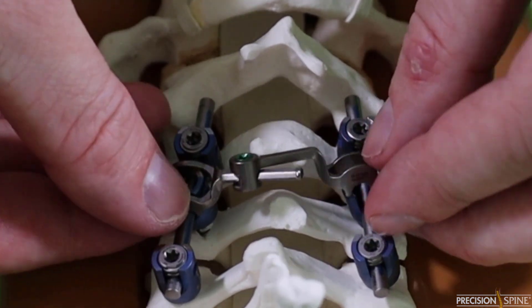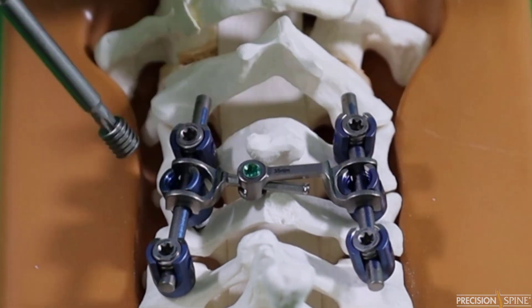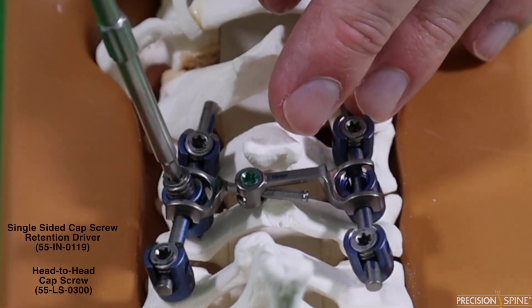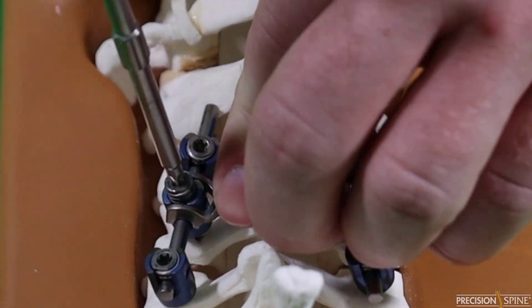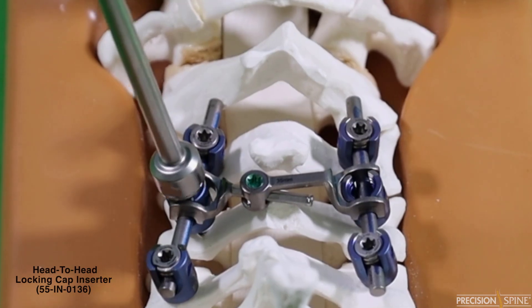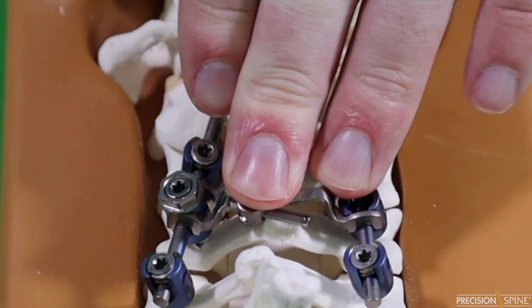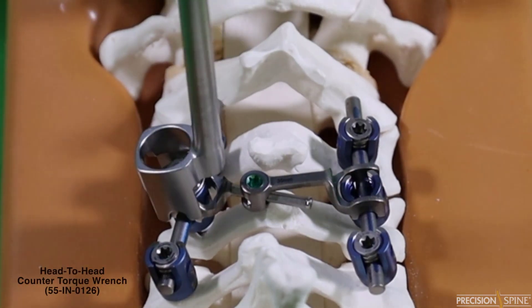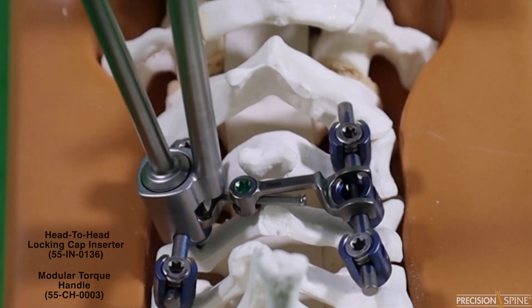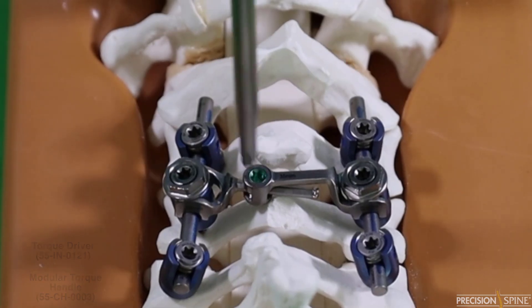The head-to-head cross connector is attached by fully seating the cross connector over the tulip rod construct. Next, insert the head-to-head cap screw into the tulip and final tighten each head-to-head cap screw. Now insert the head-to-head locking cap with the head-to-head locking cap inserter. Final tighten by placing the head-to-head counter torque wrench over the tulip and attaching the torque handle to the head-to-head locking cap inserter. Lastly, final tighten the midline cap.